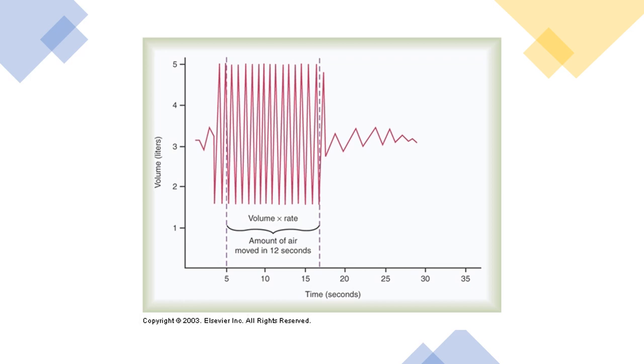All right, here's the picture, right? You're going to have the patient breathe rapid and deep for that 10 to 12 seconds, right? Rapid and deep, rapid and deep, rapid and deep. This is where the patient could pass out, right, by hyperventilating. So be very careful. They might see stars, get tingly lips, things like that. That's all something that could easily happen with this, but coaching is going to be a big one on this one.